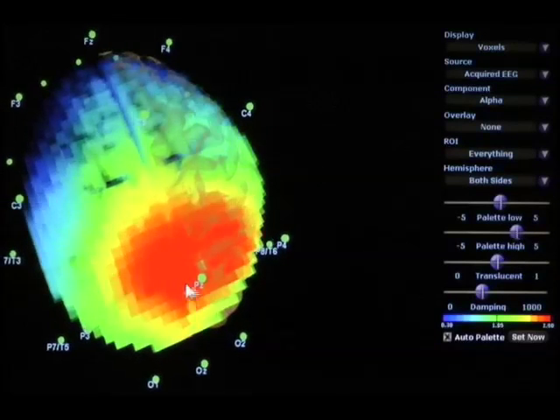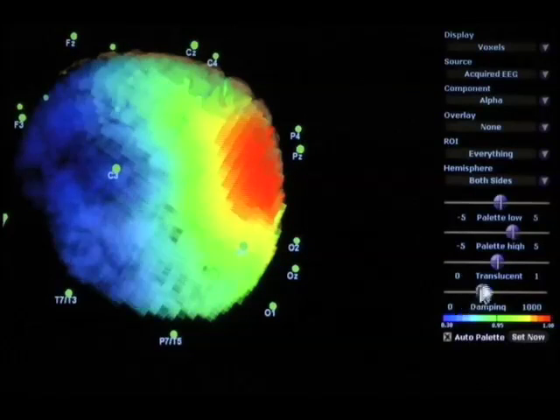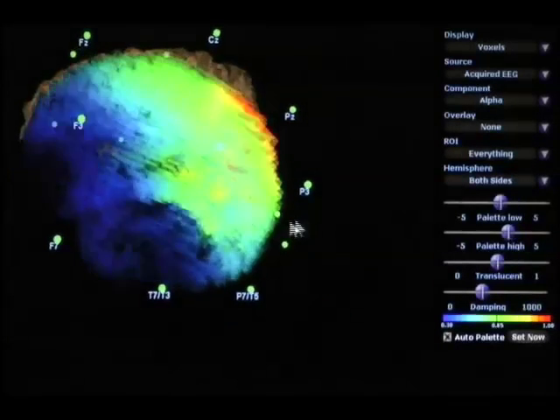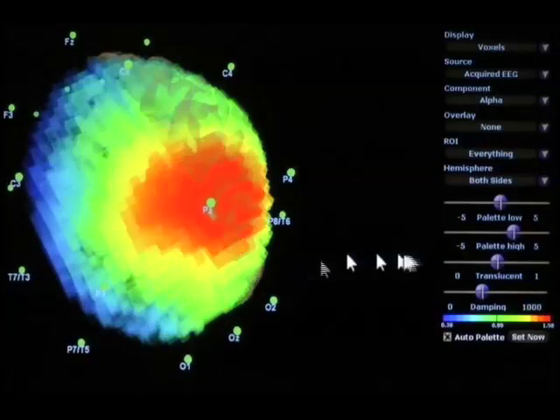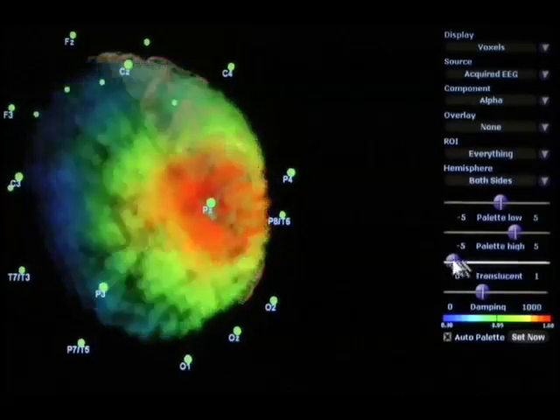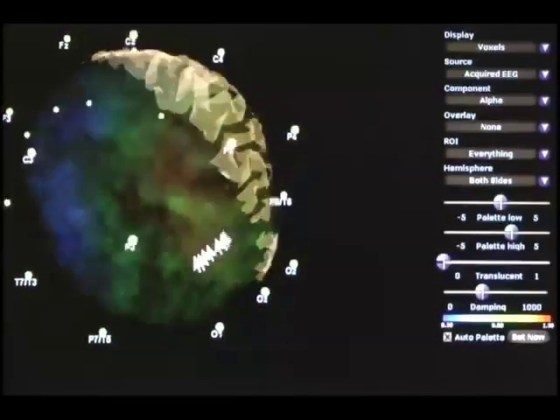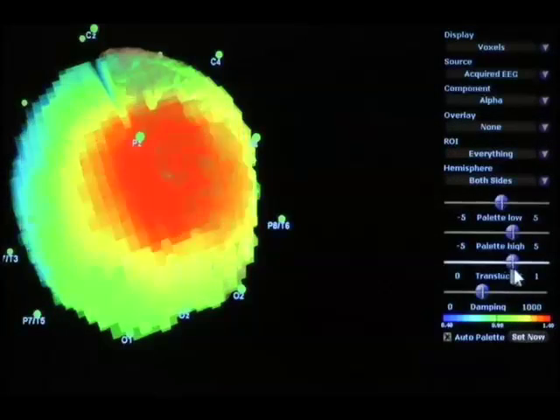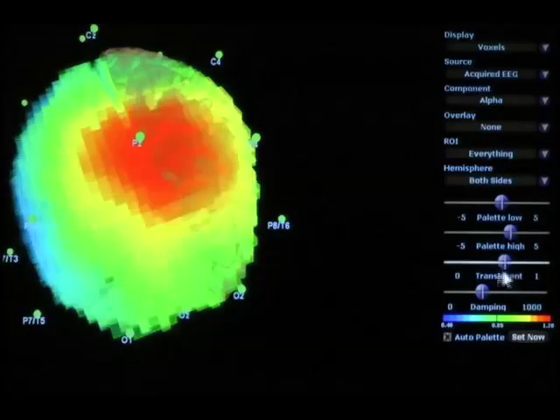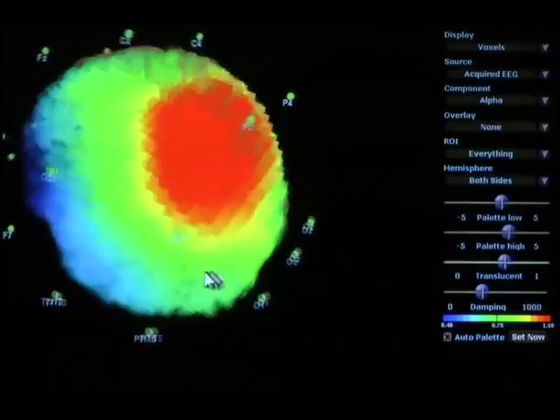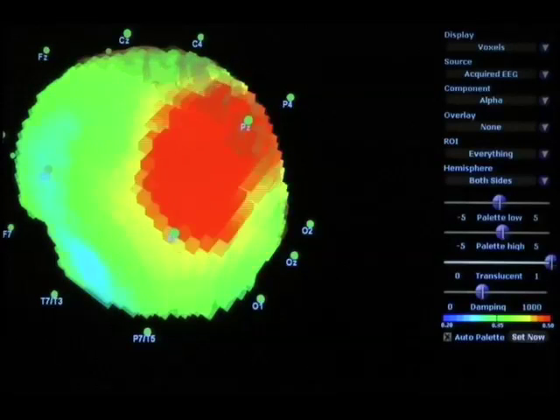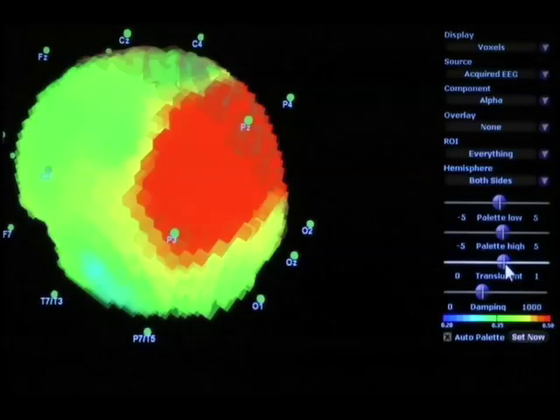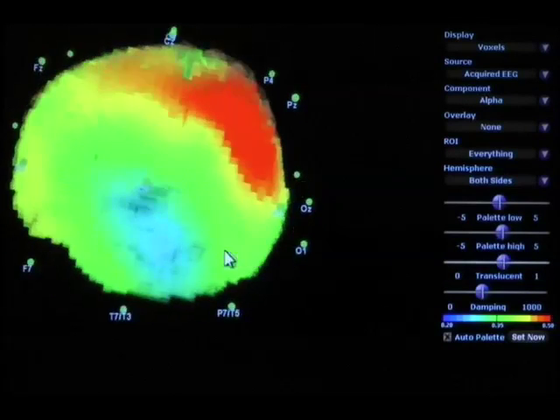I'm going to review translucence because sometimes that becomes an issue. Translucent tells where in the spectrum the voxels become translucent, which means you can see through them. As I slide translucent to the left, I get a lot less visible. As I slide it to the right and move it into the region of the palette, now I see I'm getting good visibility. Generally, you're going to want to adjust translucence somewhere in the middle of where your palette is in order to get good visibility.